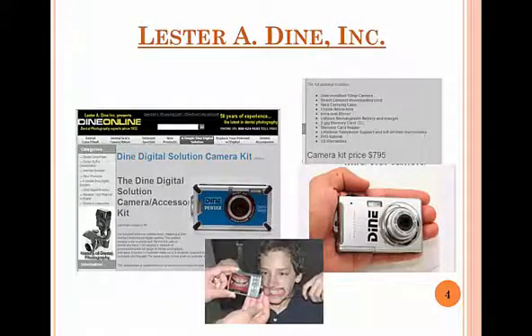This is the one from Lester Dine, which is about $800. It looks a little bit different than the modern model, but it comes with retractors and mirrors and the whole thing. You get a kit that's got everything in it that you need for $800, and this works very, very well and is very easy to use.